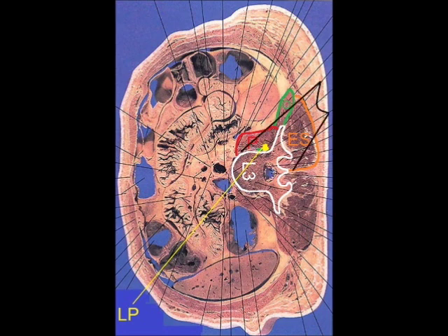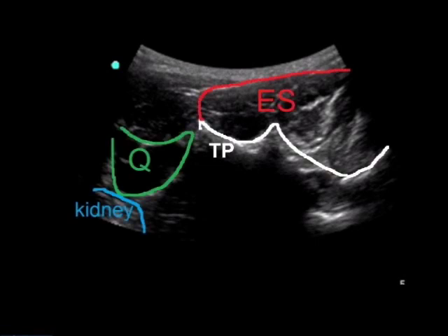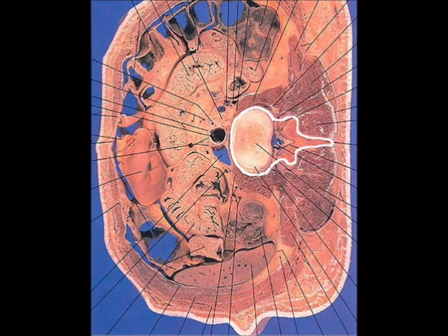When the ultrasound probe is placed lateral to the midline and rocked medially, the cut will be like this. On the ultrasound image, the transverse process is still hiding the lumbar plexus behind. So we slide the ultrasound probe in a cephalic direction. This is a cut section at a more cephalic level; therefore, the transverse process disappears.